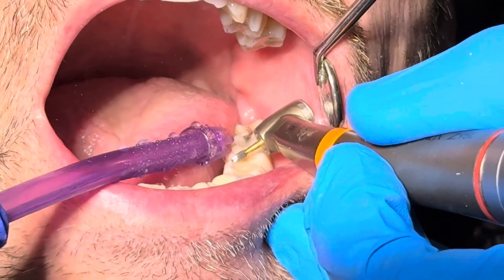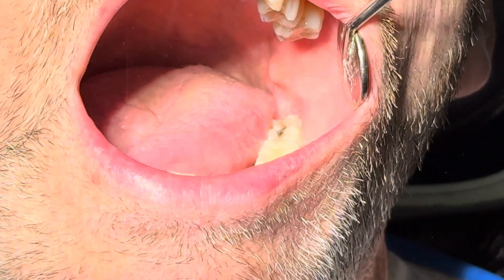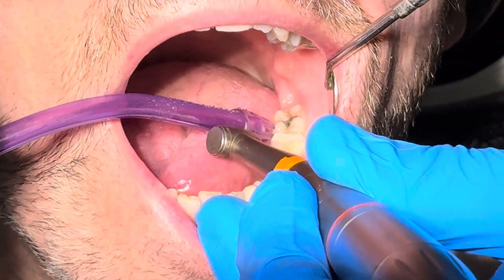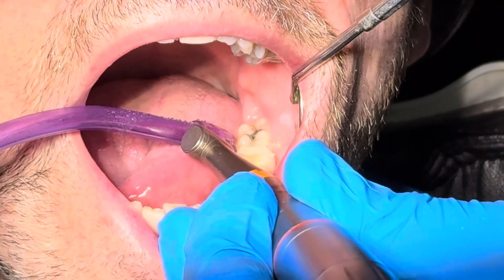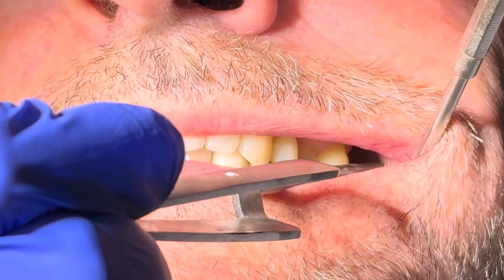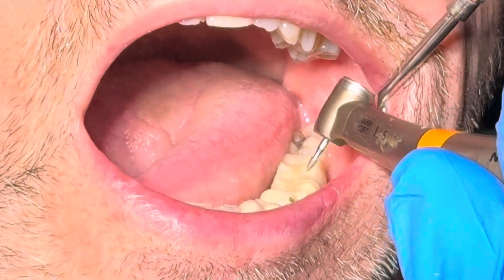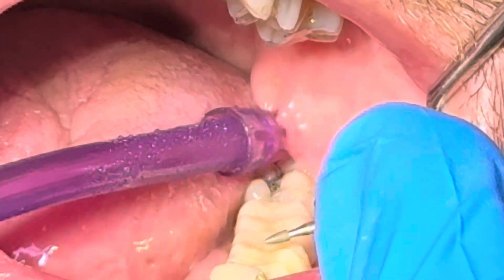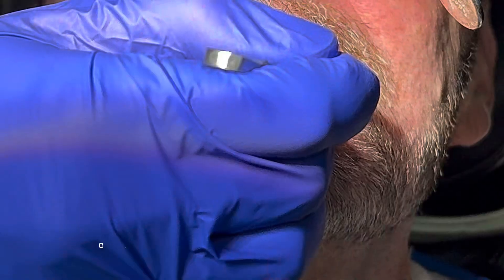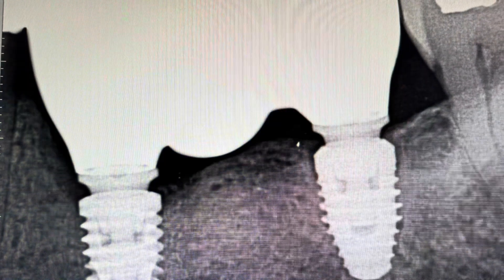When the bite is heavy you want the implant to hit light — all the surrounding teeth act like little pistons and the implant should hit lightly at that point. When going to lateral, you want to remove lateral interferences, especially in the molar region, where they can amplify forces from roughly 250 pounds to a thousand pounds of pressure. This can cause TMJ issues for the patient.